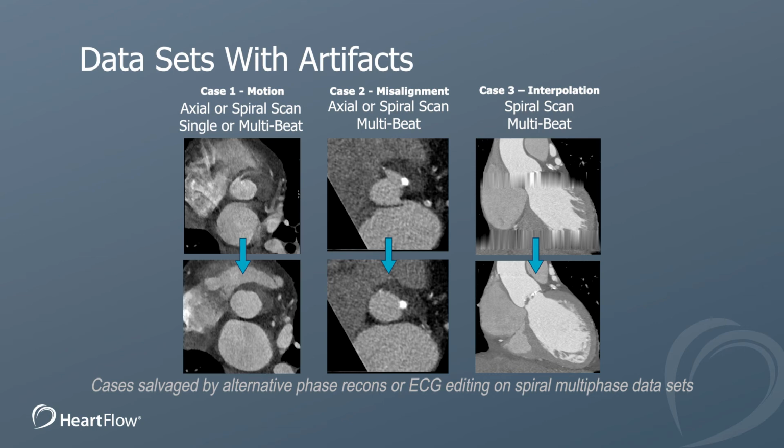Sometimes though, your reconstruction method can reconcile this if you're fortunate and the motion occurred during a different part of the patient's heart cycle. And in this case, the patient had a nice reconstruction during systole, even though it was a very poor image on the diastolic image above.